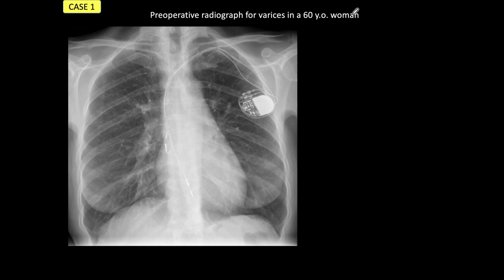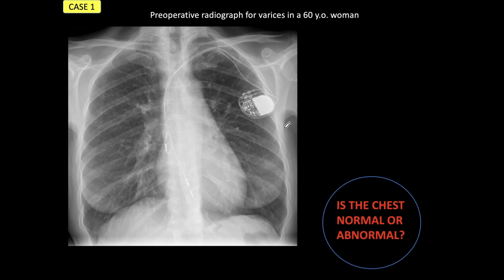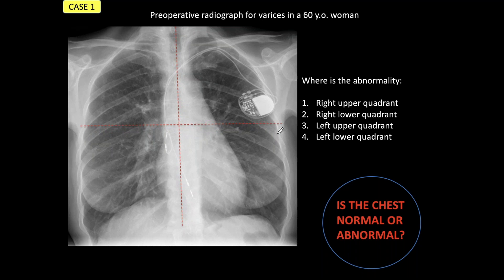This is a preoperative radiograph for varices in a 60-year-old woman. The chest appears apparently normal. We ask the question: is the chest normal or abnormal? Most of the time we would say normal, but it is not. There is a visible abnormality. I'm going to ask you: where is it? Right upper quadrant, lower quadrant, right or left upper, right lower? Look carefully at the mediastinal contour. I suggest you stop the presentation at home, take your time looking at the x-ray, and when you are finished, return to the presentation.